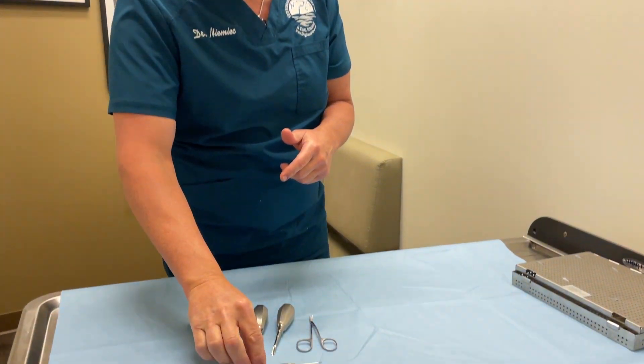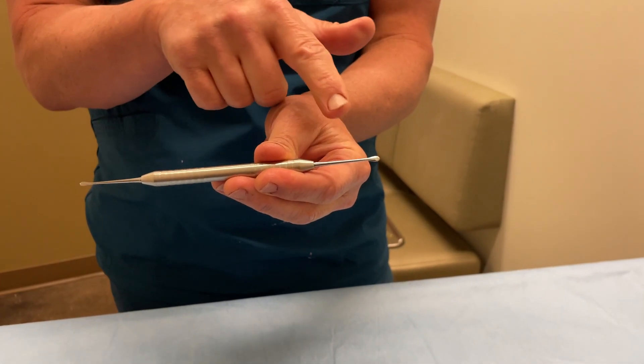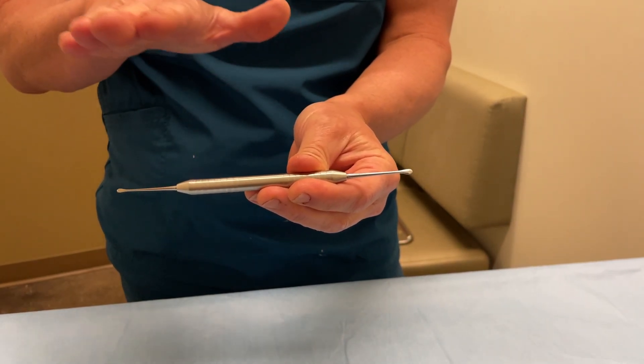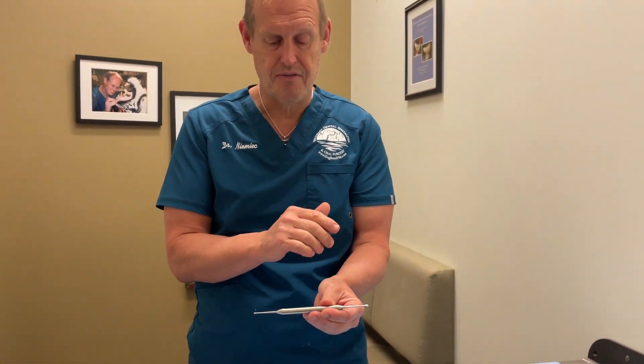Also in this kit is what's called a 2-4-molt periosteal elevator — two millimeters on one side, four millimeters on the other side. I use these to create the flaps. I make an incision, but this is what I'm going to use to lift the flap off of the gingiva and off the bone when I need to.